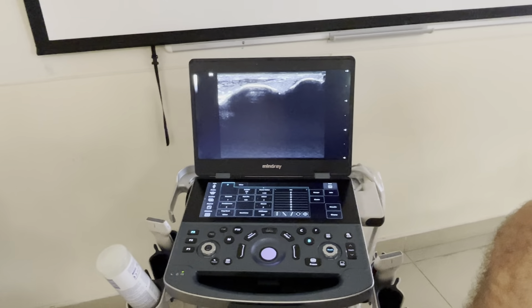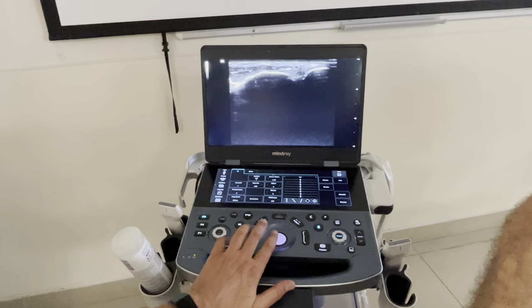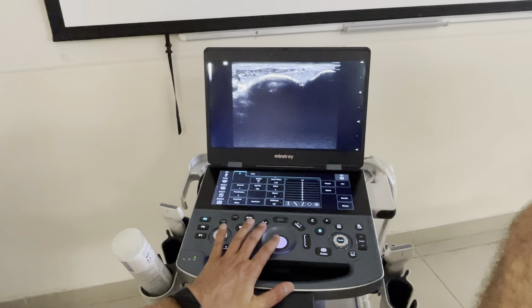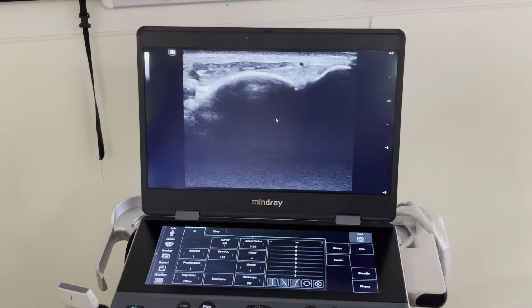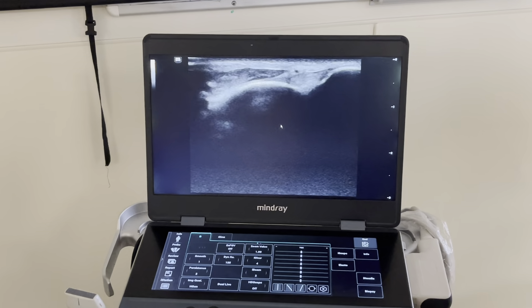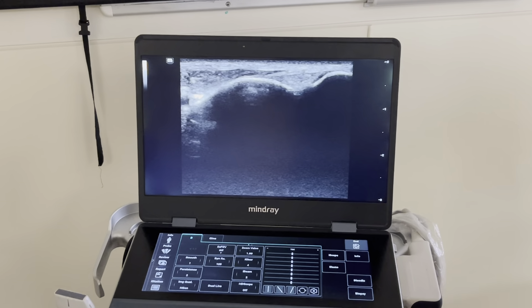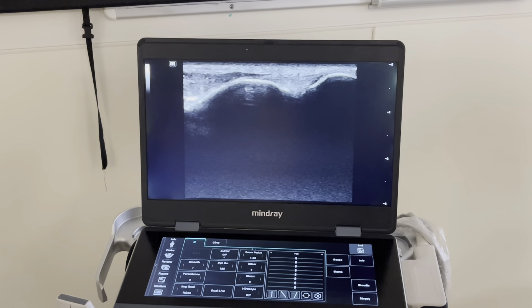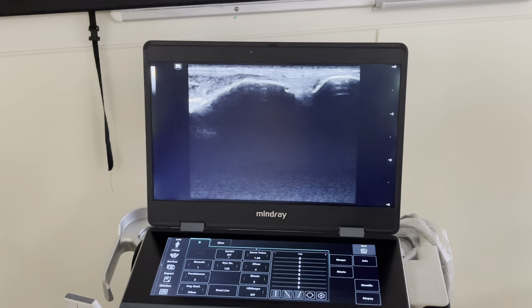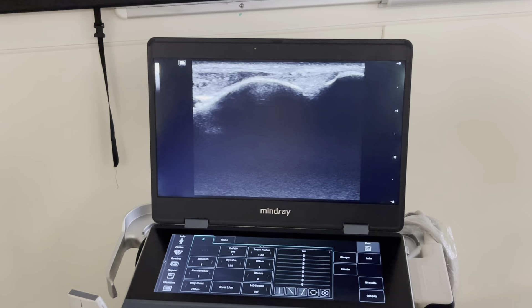Now I'm going to make this movement, and what we are going to look at is the movement between the bones — the distance of these bones — to see if there's any movement in between. Let me focus the probe as much as I can to get a good image, then we go to dorsiflexion and a little bit of exorotation, and now we move it backwards.